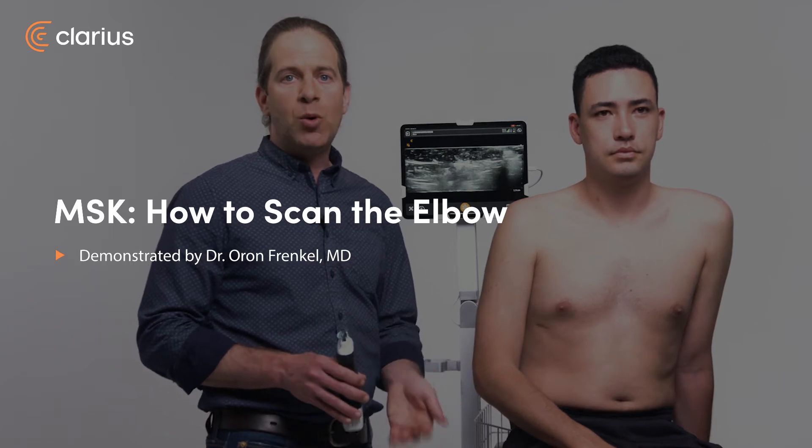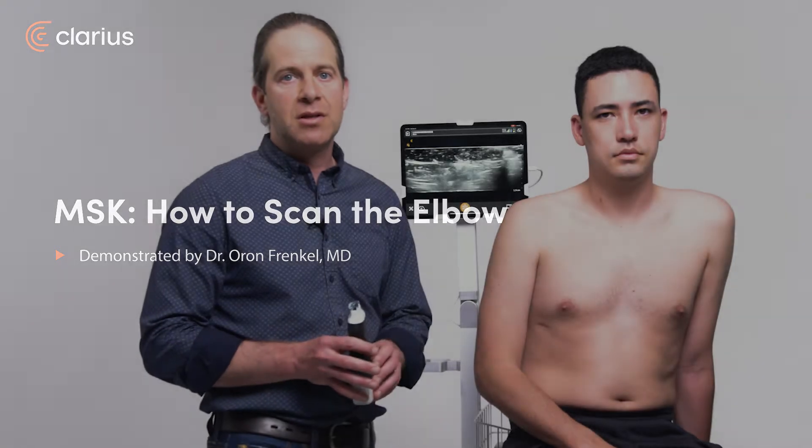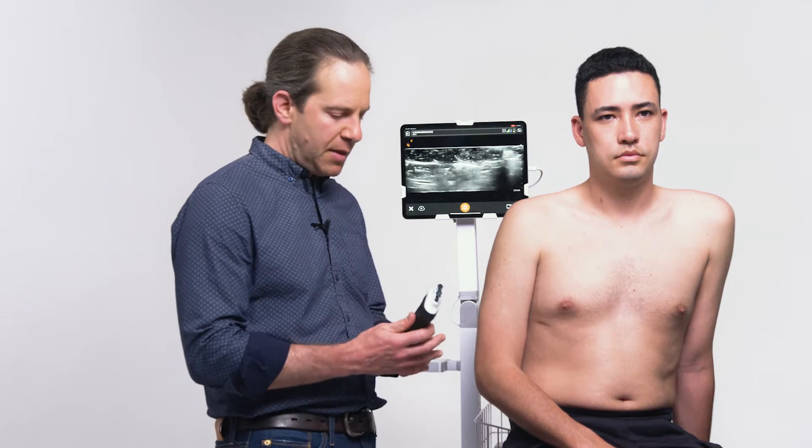In patients presenting with elbow pain, a quick focused scan can identify multiple pathologies on the differential diagnosis. To perform a focused elbow scan, I use the linear scanner, here on an elbow or an MSK preset.